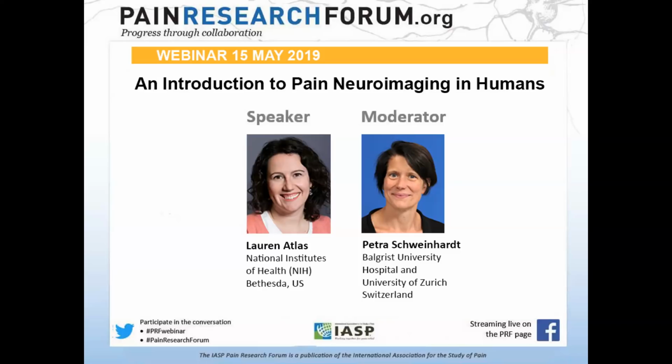And so as long as you have proper control groups, or you've measured those different kinds of outcomes and you can control for those, then I think you could use brain imaging as a way to get insight on the treatment effect. There are also ways to do this depending on the type of intervention. People use pharmacological fMRI, so you can look at how changes in brain concentration of a drug actually affect brain responses. And so I think there are many, many ways to use fMRI as a tool to measure the effects or mechanisms of treatment, but it varies based on how people set up the experiment, which is why I decided to try to talk about considerations in general so that people recognize that these are all decisions.